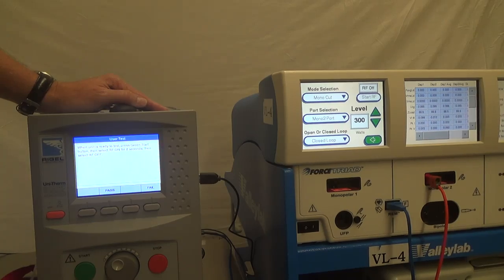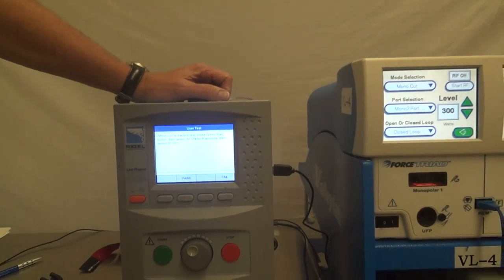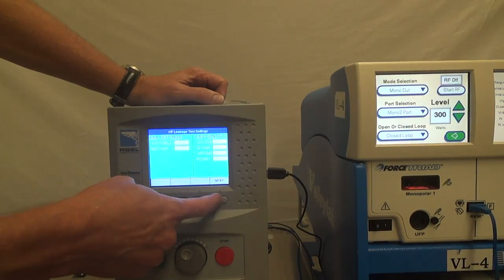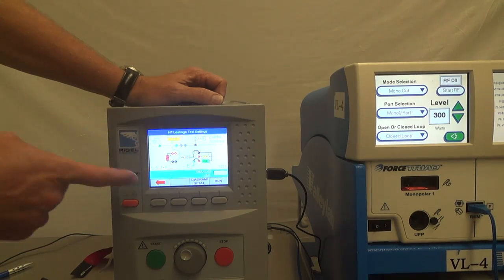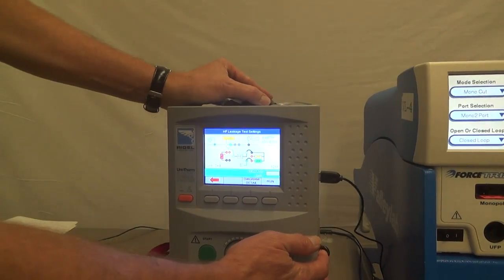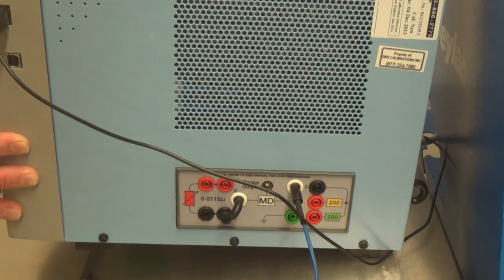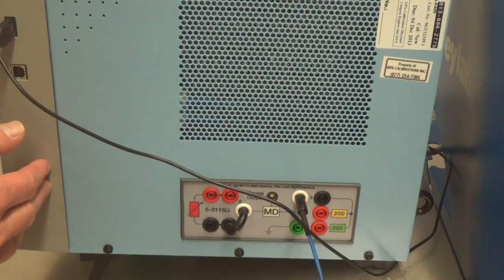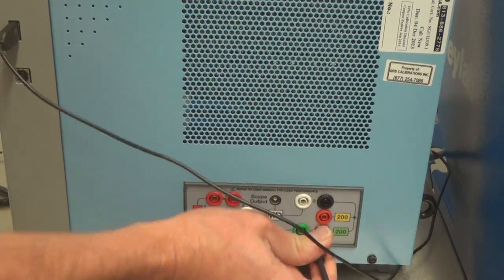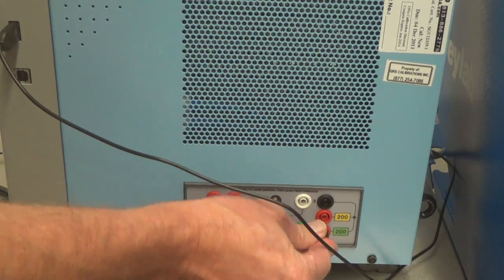So when we're all ready to do this, this sequence is the same. What's different now is the Uni-Therm is going to show you how to set this up. How do we do this? We put jumpers here.